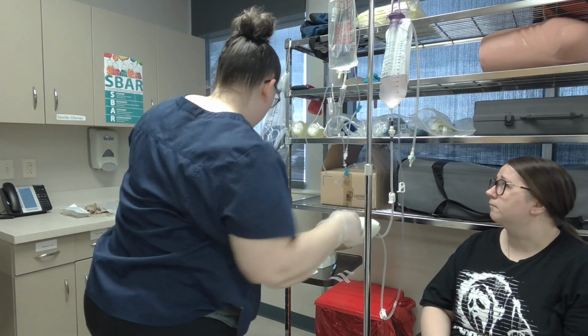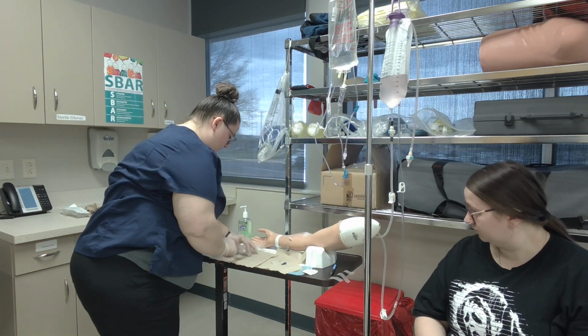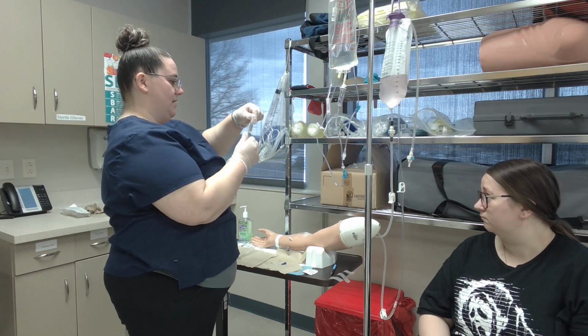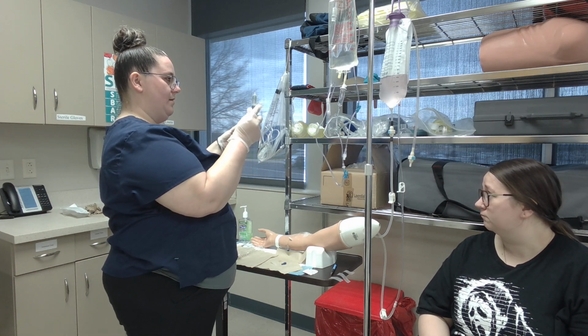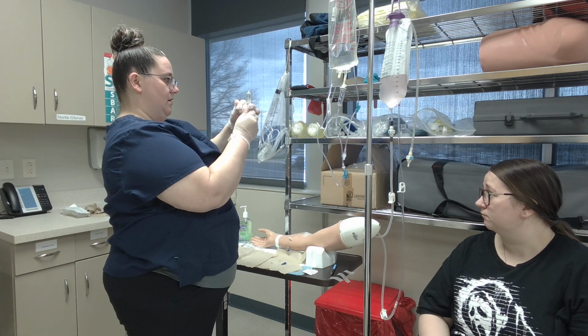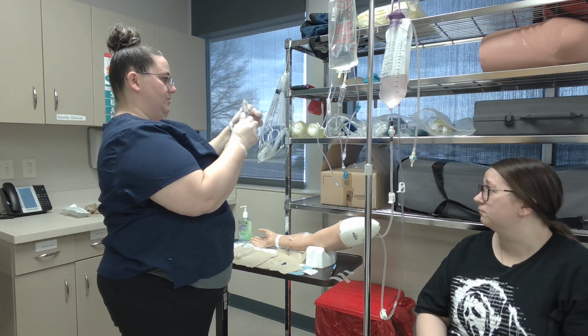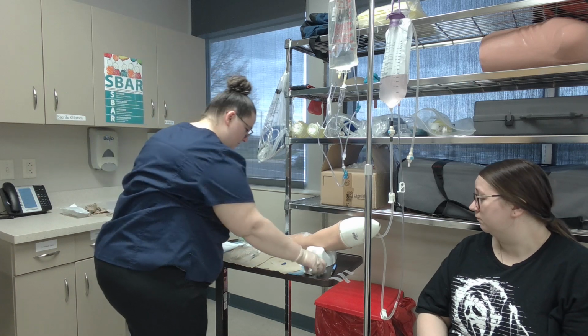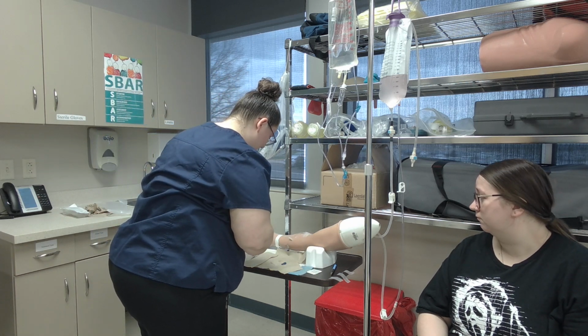And I'm hanging this up right now. All right, then I'm going to come back over here. I am going to take my flush. Make sure that I have all of the air bubbles out. Pulling it back. Okay. Air bubbles are out. Putting my cap back on. And then I'm going to scrub my hub for 30 seconds.